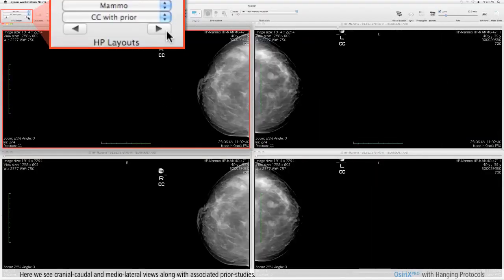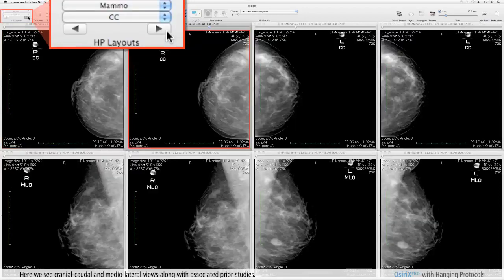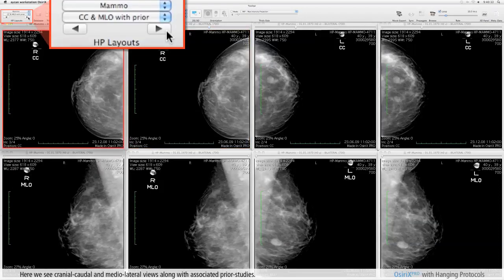Here we see cranial caudal and medial lateral views along with associated prior studies.